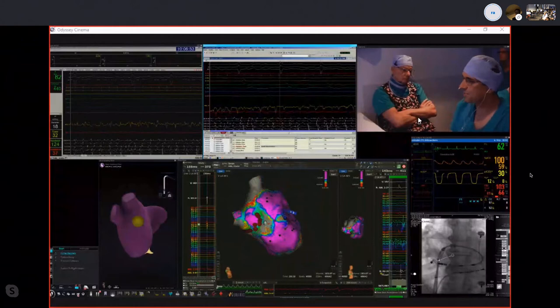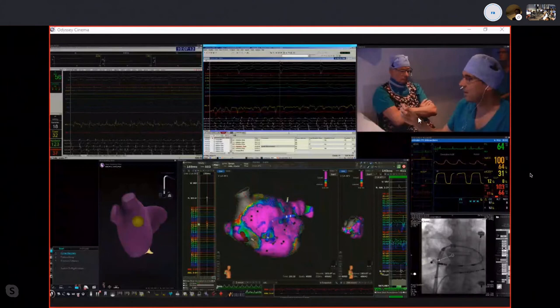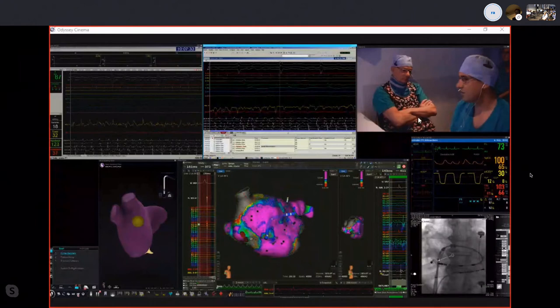Now, why is that? Most probably because this kind of approach, where the tip of the sheath is leftward oriented, like in the left part of the left atrium, allows you to have an anchoring point on the other side for the magnetic catheter and not at the level of the septum. And actually, this eases the manipulation for the right PVs with all the three magnets in the magnetic field. So we actually hypothesized that this is maybe the explanation for a quicker and more efficient ablation and disconnection for the right PVs by using the robotic sheaths.